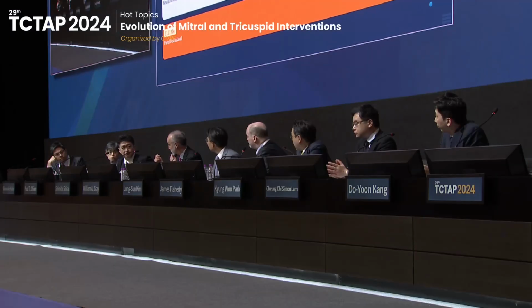Well, if there's borderline height and you think you're going to struggle for a medial lesion, I think 3.5 is plenty of height for the PASCAL, whereas with the MitraClip, it may be pushing it. Yeah, the other one that was a nice example.